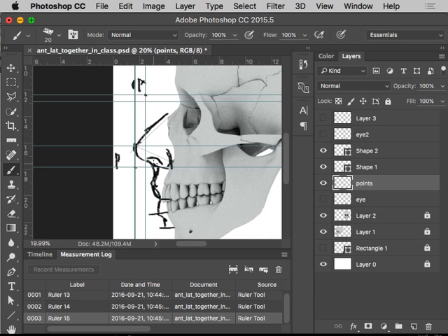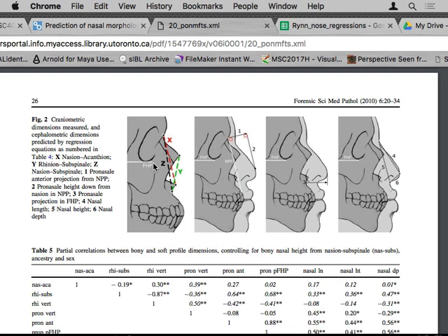So what I'd like you guys to do is not what I just did, but I wanted to show it to you. What I want you to do is use those same techniques and figure out the width of the mouth. Okay, we talked about it last week. Simple. You measure from the outer edge of the canines in the front view, multiply that by 1.33.